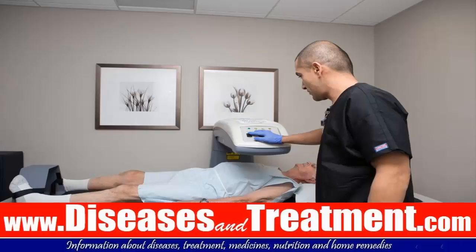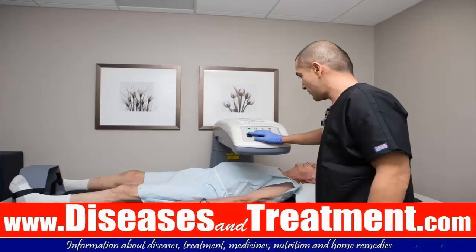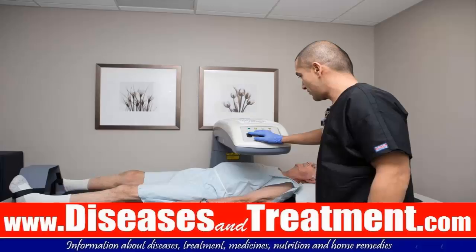This information is sent to a computer, and your bone density measurement will be compared with the bone density of a young healthy adult or an adult of your own age, gender, and ethnicity. DEXA scans use a much lower level of radiation than standard x-ray examinations, which means the radiographer can stay in the scanning room with you during the scan.